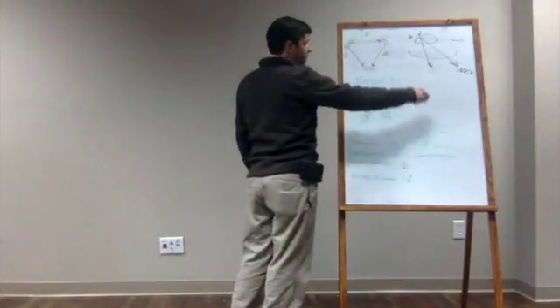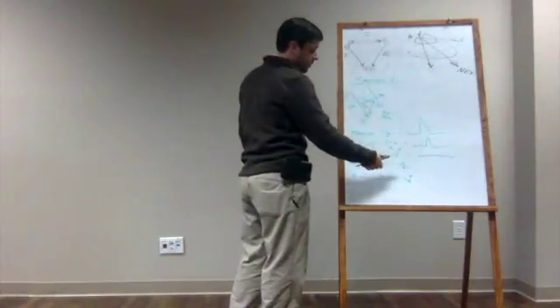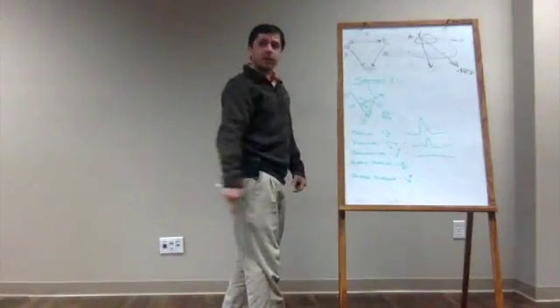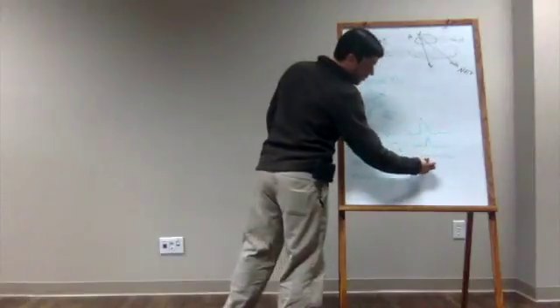Now, oftentimes, conduction will actually go against our positive lead, going towards our negative lead. And if we apply what we know with positive deflections, what do you think a reverse parallel would look like? Negative. It would be negative. Would it be medium, big? Big negative deflection, correct.